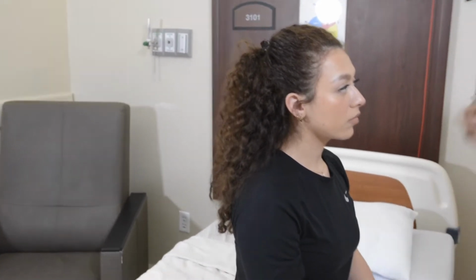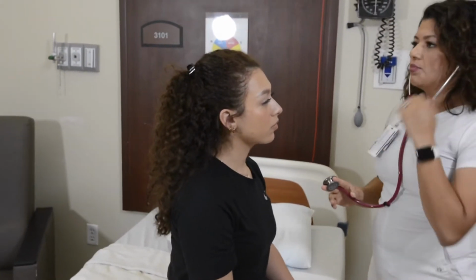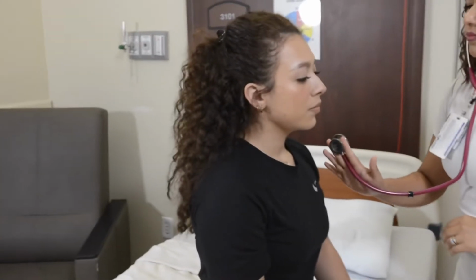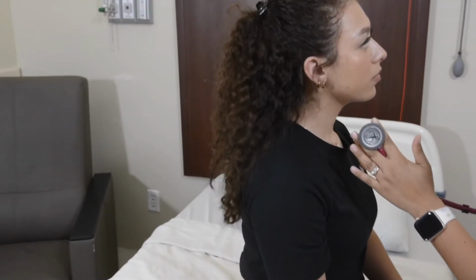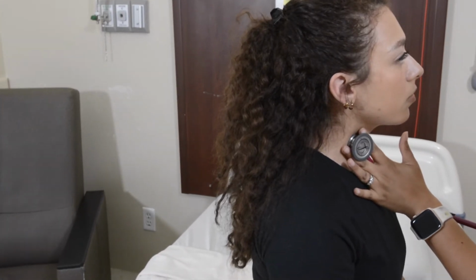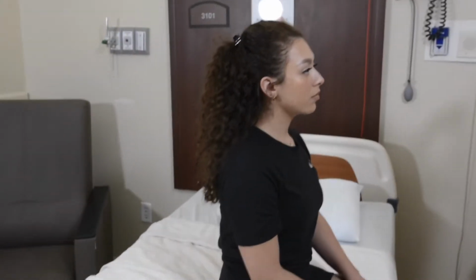Very good. Now I'm going to listen, and what I need you to do here is take a deep breath in and blow all your air out and then hold it. Okay? You ready? Hold it. And here I'm listening with the bell part of my stethoscope. Now we're going to do the same thing on your right side. Breathe out and hold it. Very good. Everything sounds good.